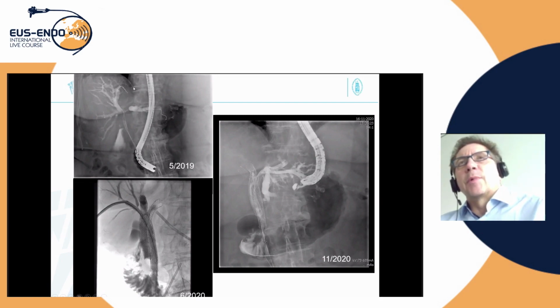The patient was inoperable, and because of a Klatskin 3B malignant lesion, stents were placed that ultimately obstructed, and more stents were placed. I think we are now sitting with 4 or 5 stents in the biliary tract. Endoscopic therapy is no longer feasible, and the patient was again only good for a while before presenting with recurrent cholangitis, before being referred to us for endoscopic ultrasound drainage of the left lobe.